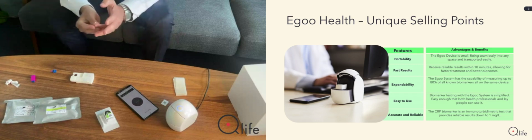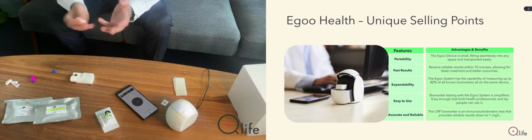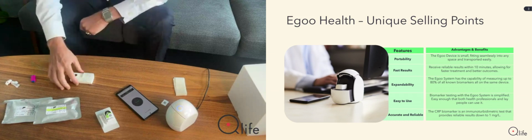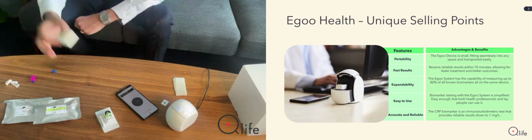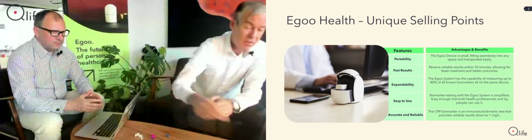So now you can do that in the home, and that's actually something we are extremely proud of, that we are capable of doing. No one else, as far as I understand, in the world is capable of doing that. And you patented all this? Yes, we have patented this little device here. Yes. We have 1 IP on that one. Yeah. And we have 2 IPs on the actual system.